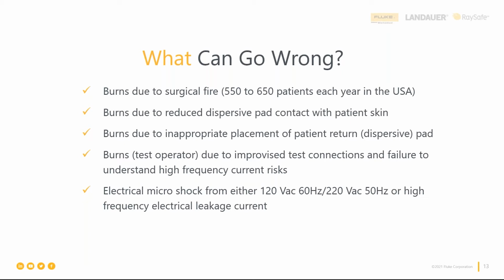Oh, go ahead. I'd like to tie in there. This is something I really didn't understand when I went through school. I assumed that once this pad is placed on a patient, you can monitor it, you can see it. It wasn't until I actually got to go out and help out in some surgical cases that I really understood that this pad is put on in prep for the surgery, and it's typically in a location under the drapes that you can't see once the surgical procedure starts. So as a tech, if you haven't had a chance to go in and watch a surgical case, it's really helpful, especially for the young guys, to go in and actually see how the equipment that you work on is being utilized, to understand about this contact quality monitor pad and just where it's placed.